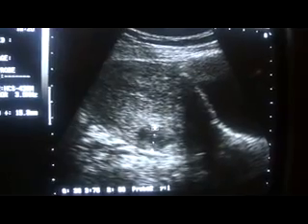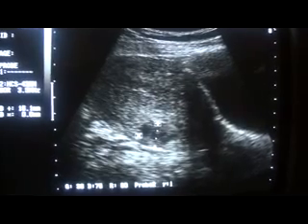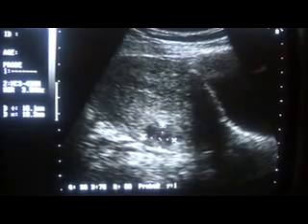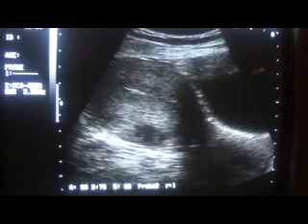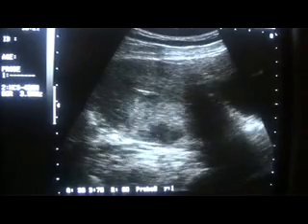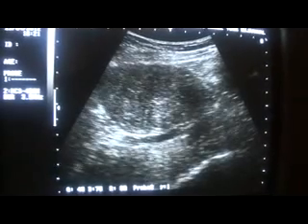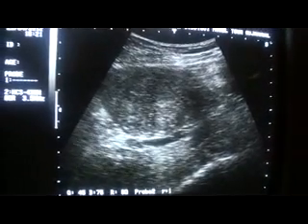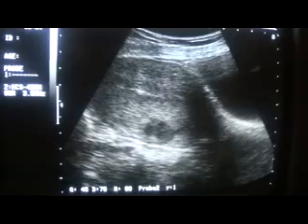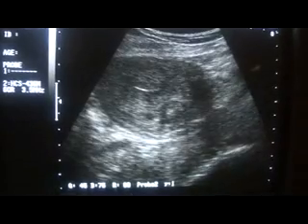So you see this one, this is the largest of all, measuring 20 into 20 millimeters, being echogenic in the center with a hypoechoic periphery, very well demarcated, no posterior wall enhancement, and no calcification seen in any of these lesions. Female is tender to the probe in this region.